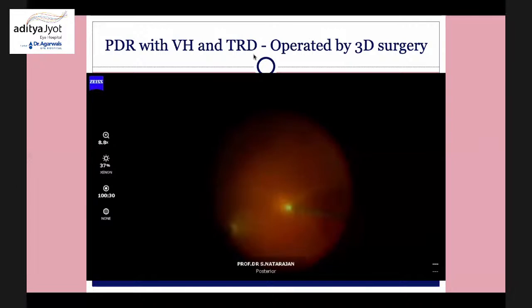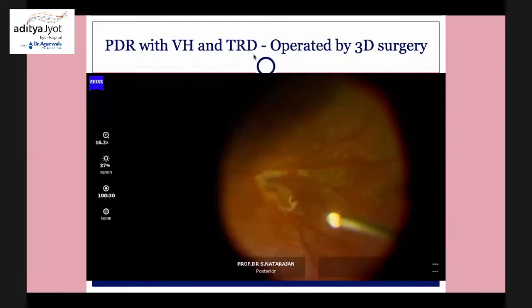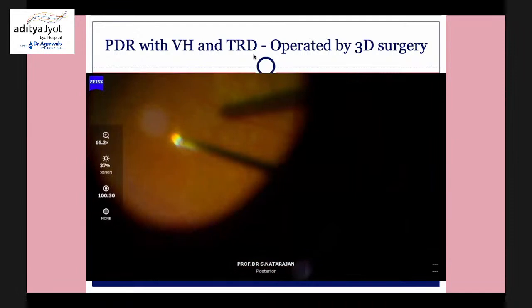And here I'm using steroid under air to stain the uncut vitreous, and then I use fluid-air exchange again, reinfuse the fluid, just to check where the uncut vitreous is, and accordingly I can see only an island of some vitreous left behind. I'm now using the brush to check that, and then clear all that debris so that all traction is relieved. And I'm using high cutting and low suction so that I can work close to the retina.